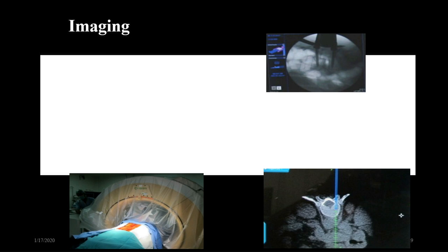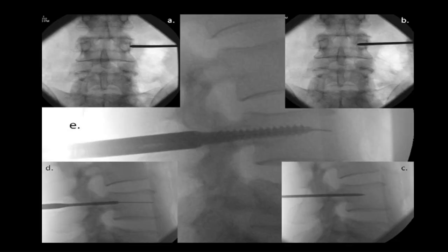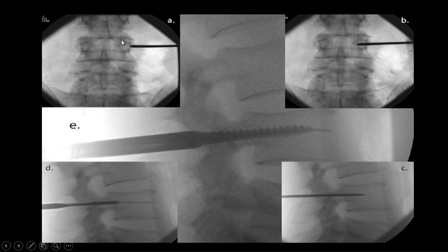The steps, as discussed previously: if you have some kind of guidance or navigation, that is very good; otherwise you have to do it under fluoroscopy. If you have a fluoroscope and want only one view - AP is always best. Always do your percutaneous procedure under AP - anterior-posterior view - to see the pedicles. Your pedicles have to be visible as oval shapes. This is what you are supposed to see - these are the pedicles - and the spinous process has to be in the midline, confirming a true AP.